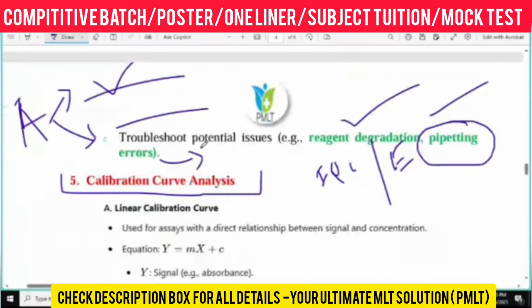What are the types of error? Analytical, pre-analytical, and post-analytical. Can anyone give me one example of a pre-analytical error? Wrong sample collection, right? And say one example of an analytical error. Instrumentation problem, instrument fault, instrument failure, right?